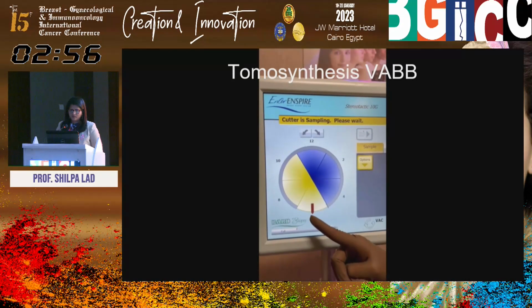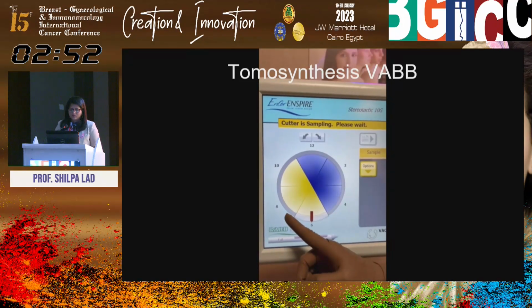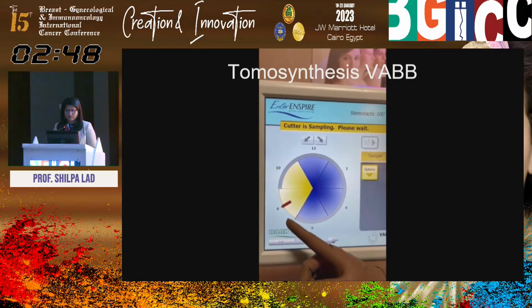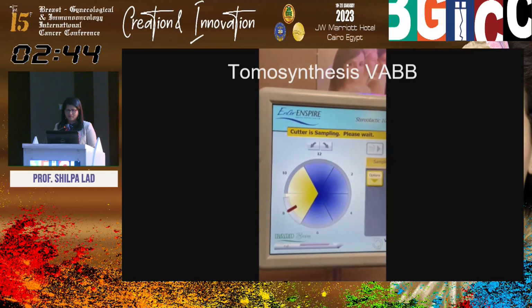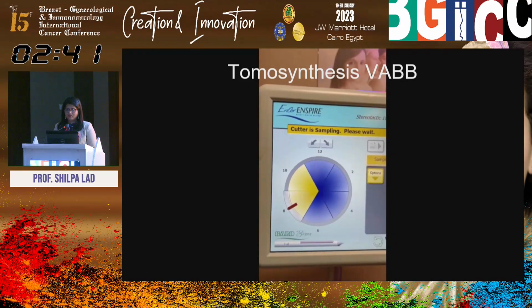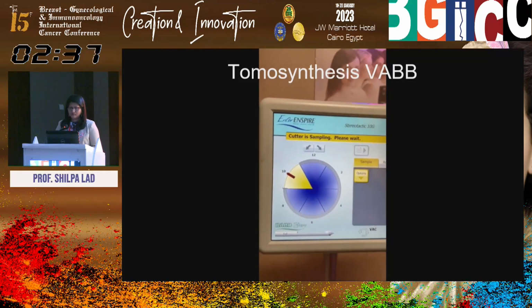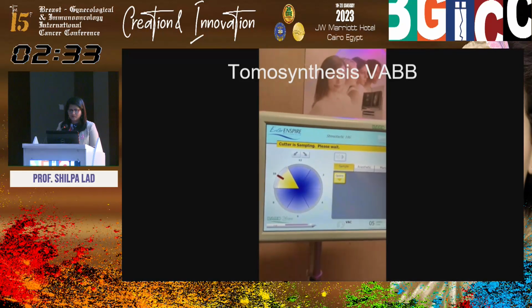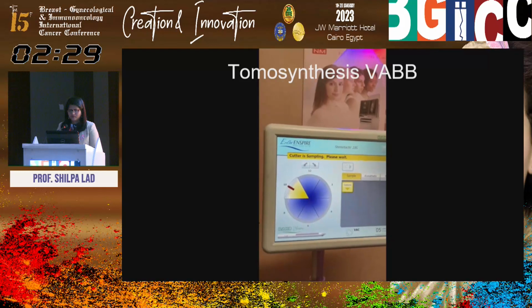After the 6 o'clock is done, we're going to be at 8 o'clock right here. Okay, so we are almost there. We have obtained 5 samples, and then the last sample at 10 o'clock. Okay, so once these 6 samples are obtained, we're going to stop right here, and we're going to check if we have got the optimal sampling.